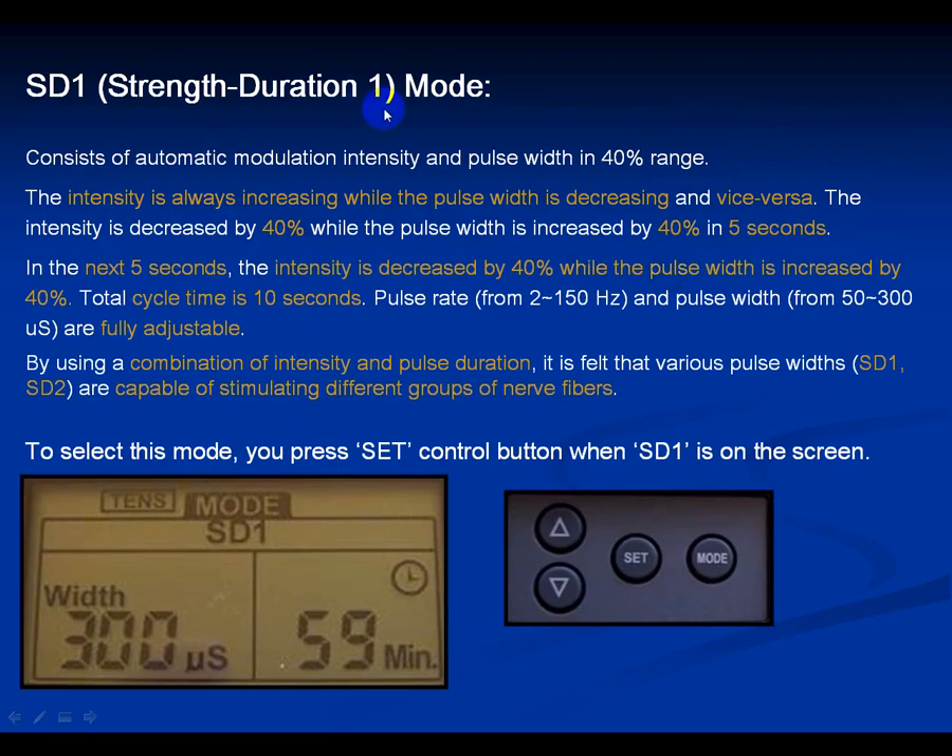Strength Duration 1 and Strength Duration 2 consist of automatic modulation of intensity and pulse width in a 40% range. Once you set the pulse rate and pulse width, the width decreases while the amplitude dials effectively go up, and when the width increases, the amplitude goes down — automatically, within a 40% range. You can change the rate from 2 to 150 and the width from 50 to 300. Practice this on a good muscle group to really feel what it's like.